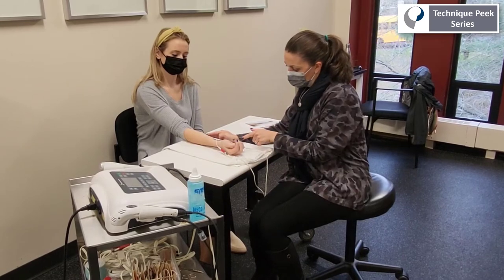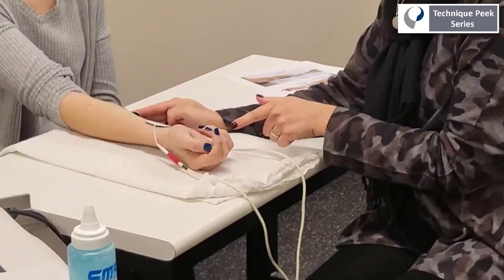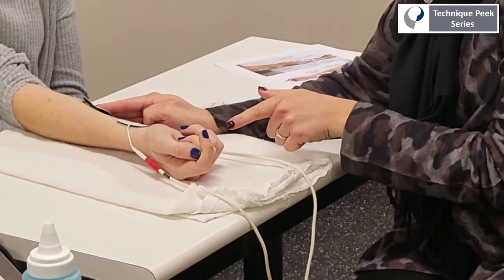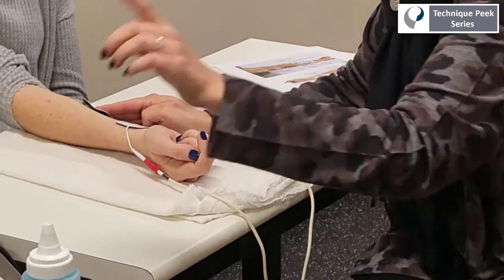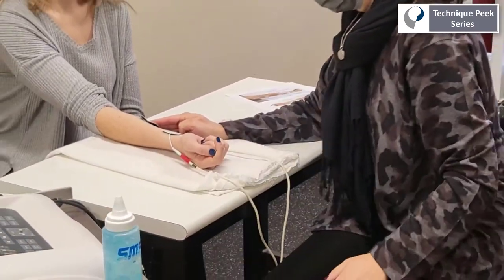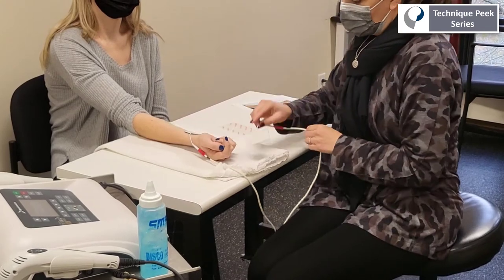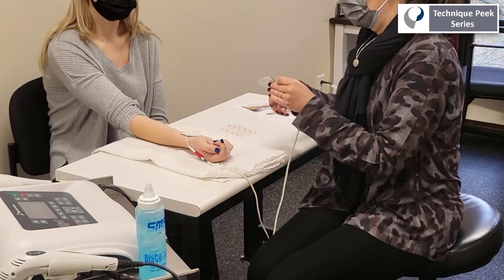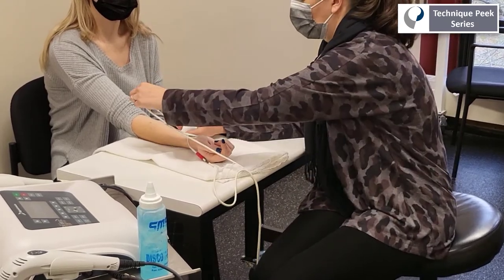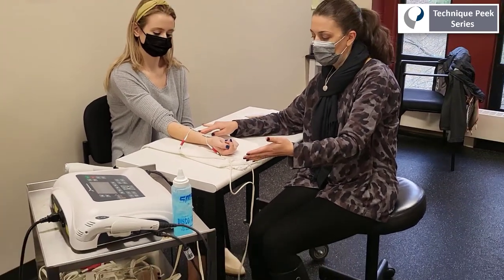As we zoom in here, you can see that now we are getting right over that FDS. Once we find it, we're going to go ahead and pause the machine, but keep an eye on where we had that electrode pad. Then we can clean the gel from the skin and the electrode pad, replacing it in the area where we pinpointed our target muscle — in this case the flexor digitorum superficialis — and then we know we're going to get the desired motion.